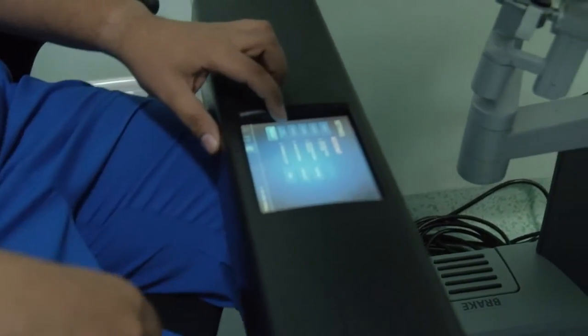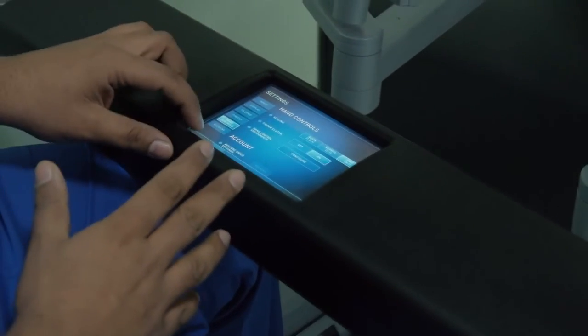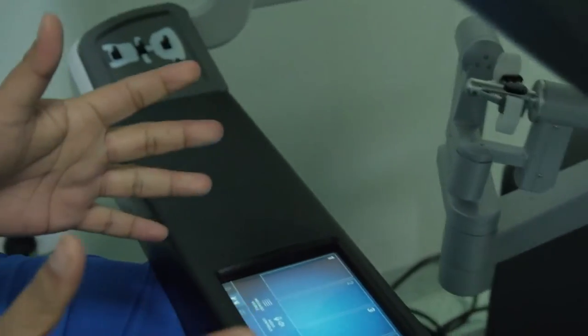Also, we can have various settings in our account. So this is kind of the master controller of the entire system, where you can control almost everything sitting at the surgeon console. It also has a simulator for training people.